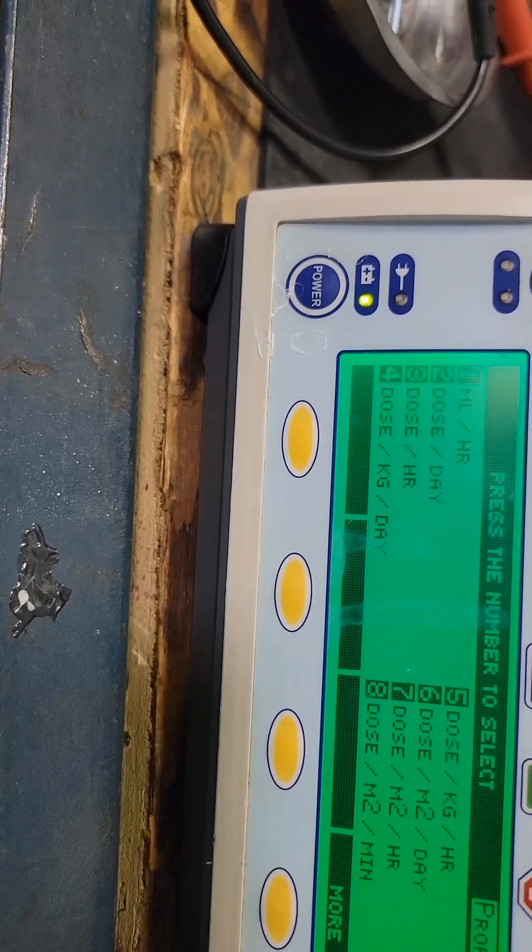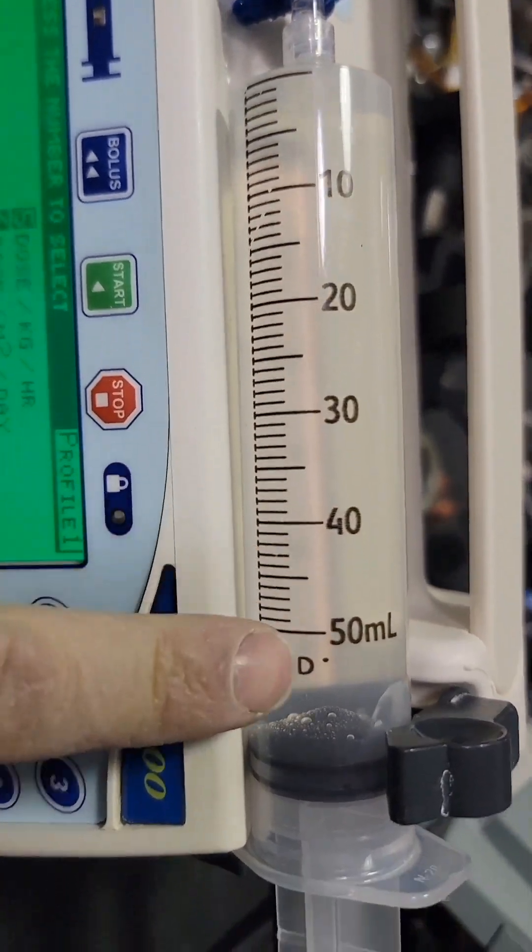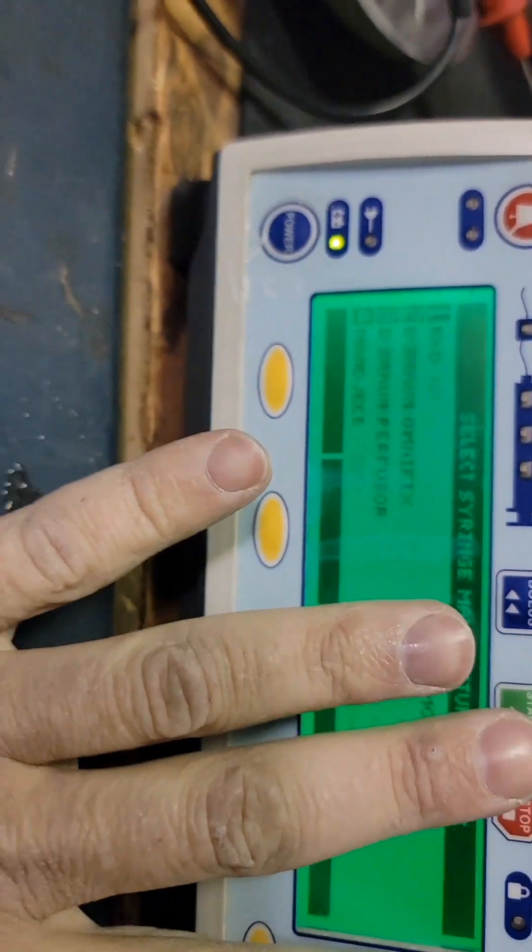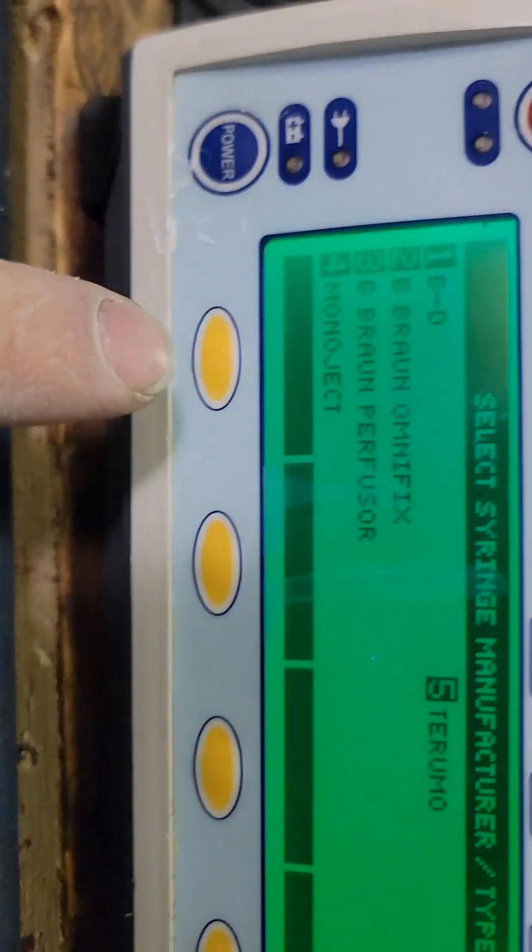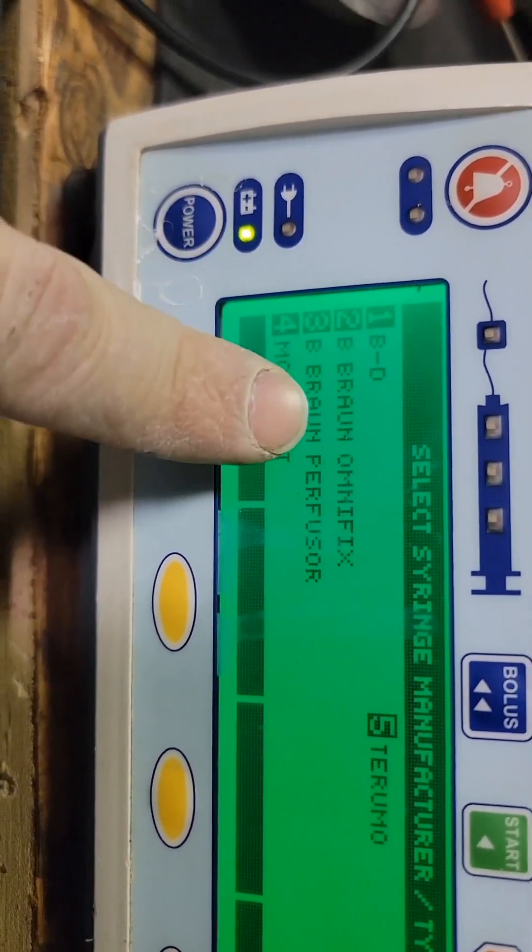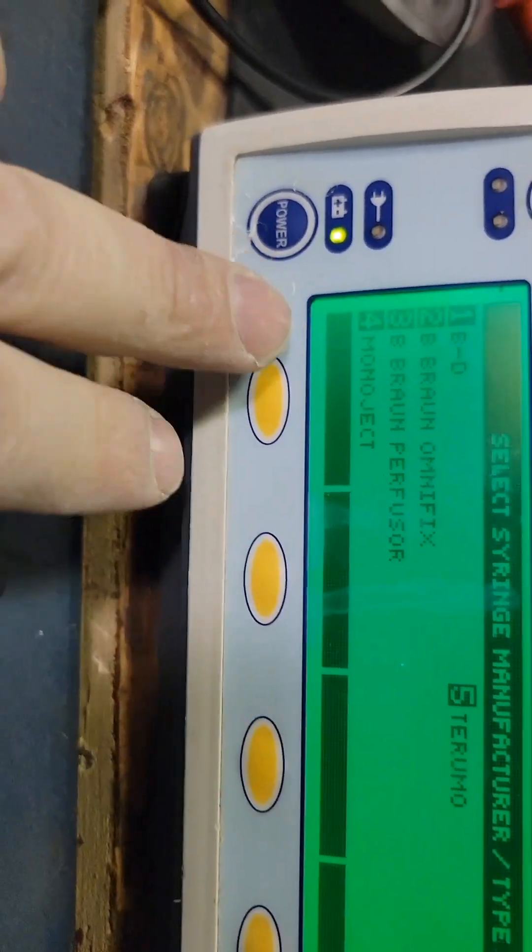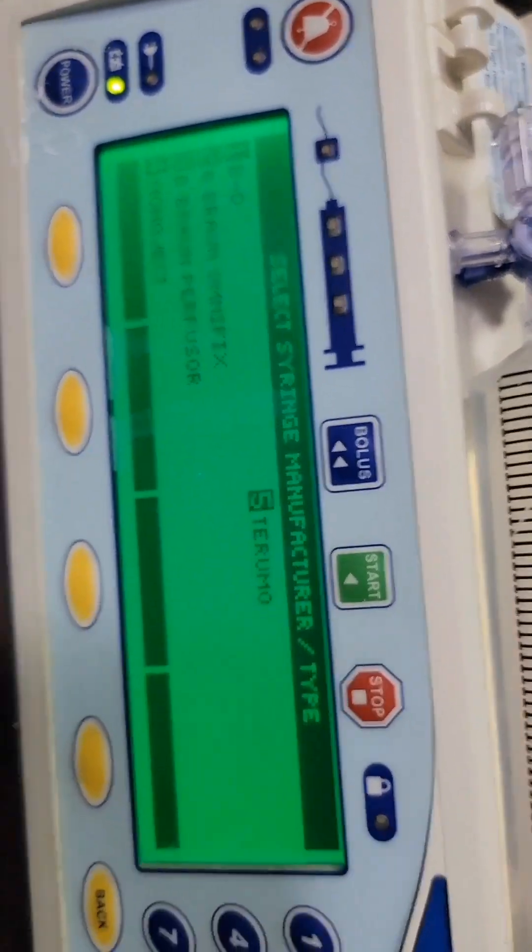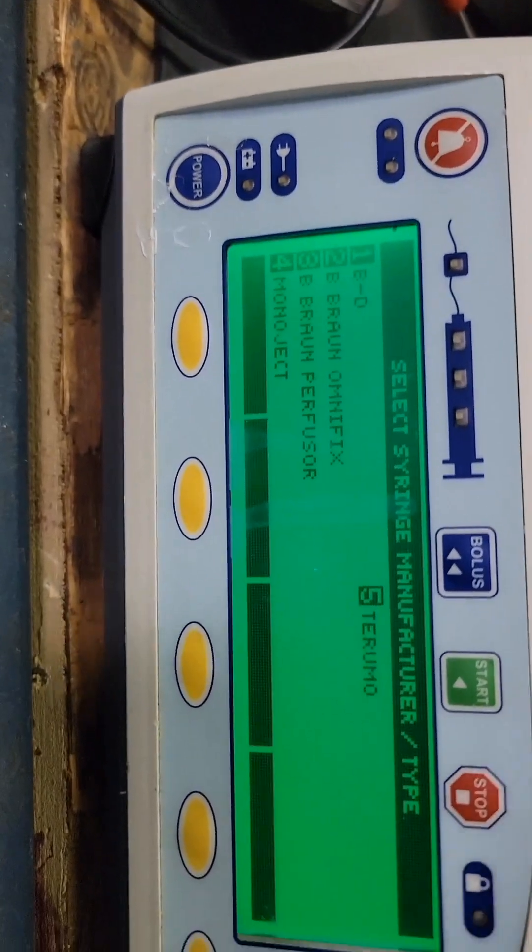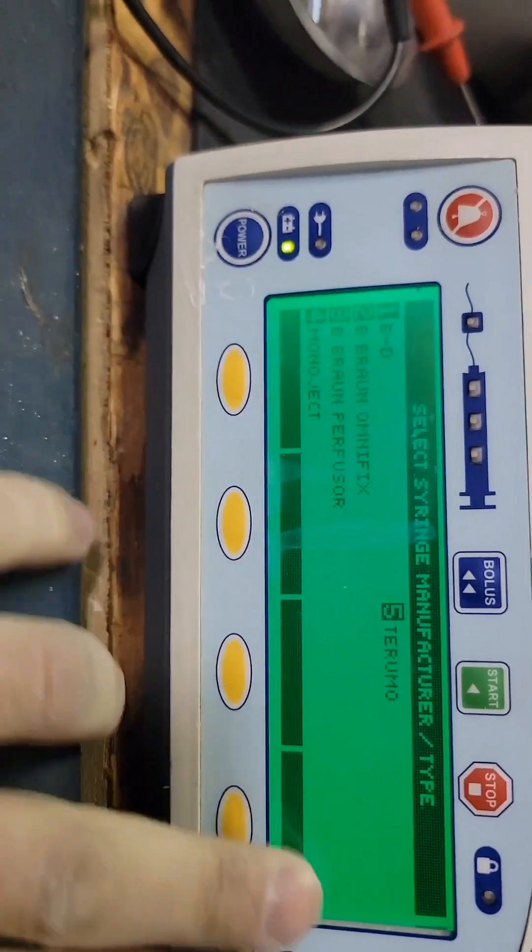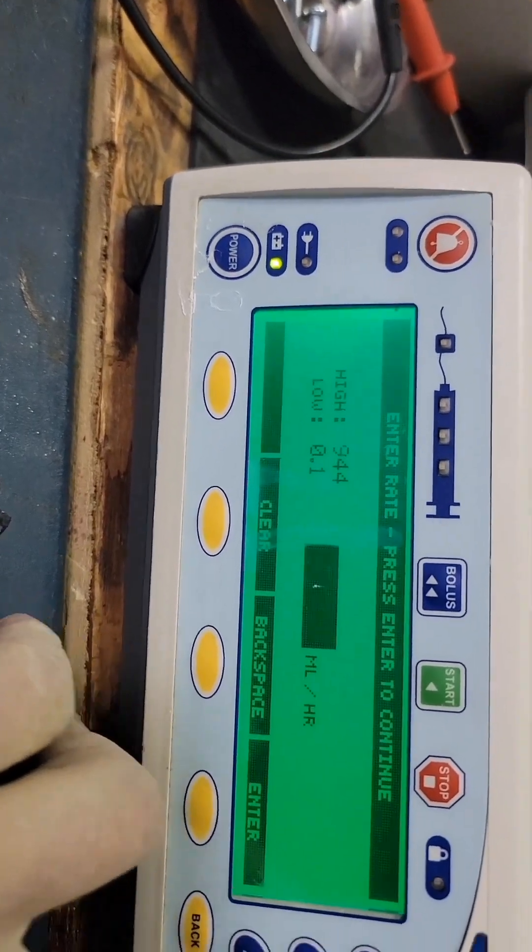After all this I'm just going to do a quick test. I have 50 milliliter, but I also know where my 60 is. So, BD, this is what's in this library. BD, Terumo and Monoject. As you will notice there is no Henry Schein, there's no McKesson, there's none of these other companies that just slap their name on stuff, so you really can't use their syringes on this system.